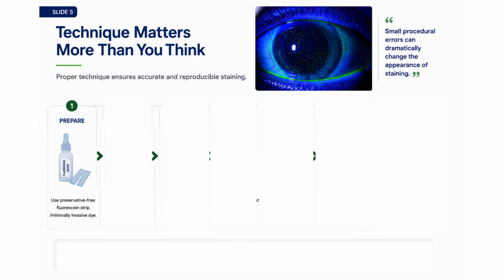The most important step in staining is the right amount of fluorescein. One of the commonest mistakes we make is to use too much dye. We soak the strip in an entire drop of anesthetic or saline and paste it onto the conjunctiva. That floods the tear film with fluorescein. Instead, the strip should be just lightly moistened. A small amount of dye is all that is required.